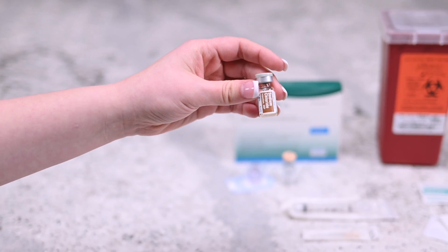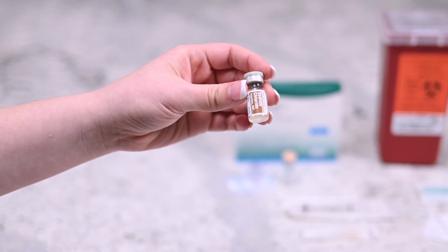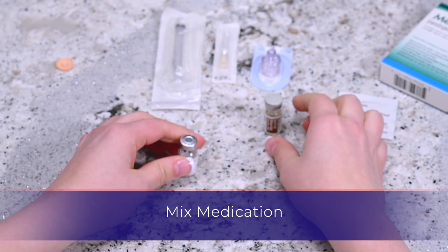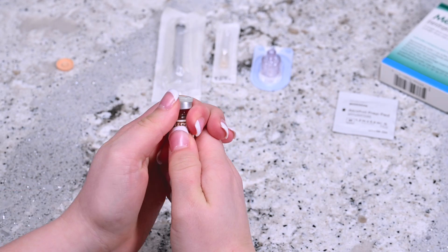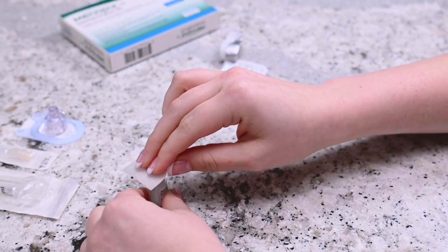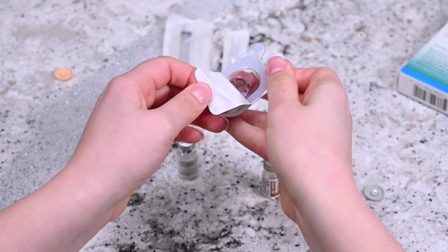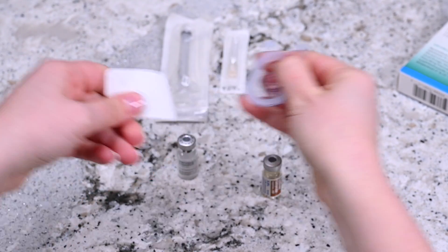Check to make sure that the vial of sterile diluent does not contain any free floating particles. Remove the cap from the vial of Menopur powder and the vial of sterile diluent. Disinfect the top of the vials with an alcohol prep wipe. Put back the top of the q-cap packaging but do not remove the q-cap from the packaging.